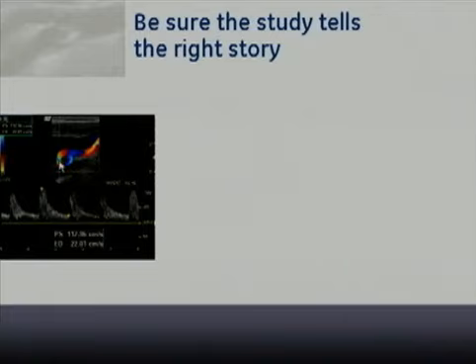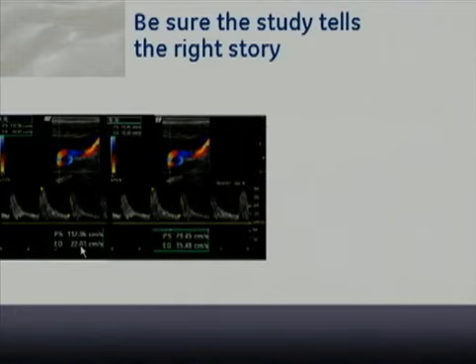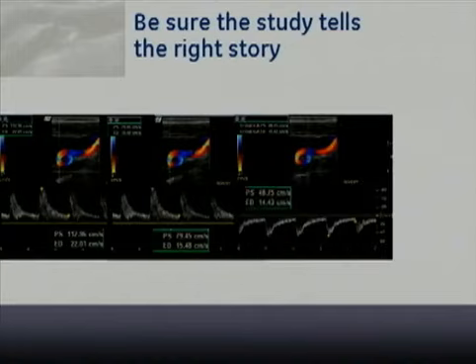And then as I moved into the coil, all of a sudden the velocity jumped up to 112. This didn't really make sense to me because there's no stenosis, no narrowing. Actually, it was just an angle correction error, and when I lift off the probe or update the image, I could see that I had moved slightly. I adjusted the Doppler angle very carefully for the area that I'm in within this coil, and I have a good velocity. So it was really closer to 79 or 80 centimeters per second in this area, not 112.